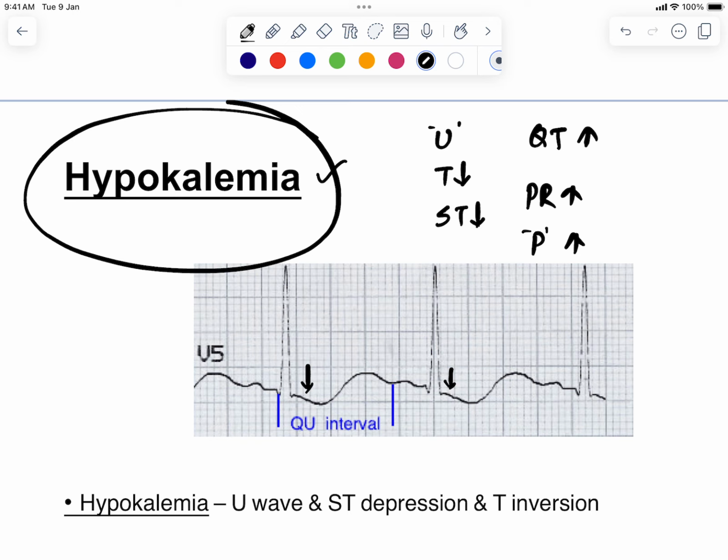But ST segment depression in case of digoxin effect has multiple names. So you have inverted tick sign, it is also called hockey stick sign, it is also called inverted mustache sign, and it is also called Salvador Dali sign. Okay, so this completes the discussion of your ST segment abnormalities. Thank you very much.